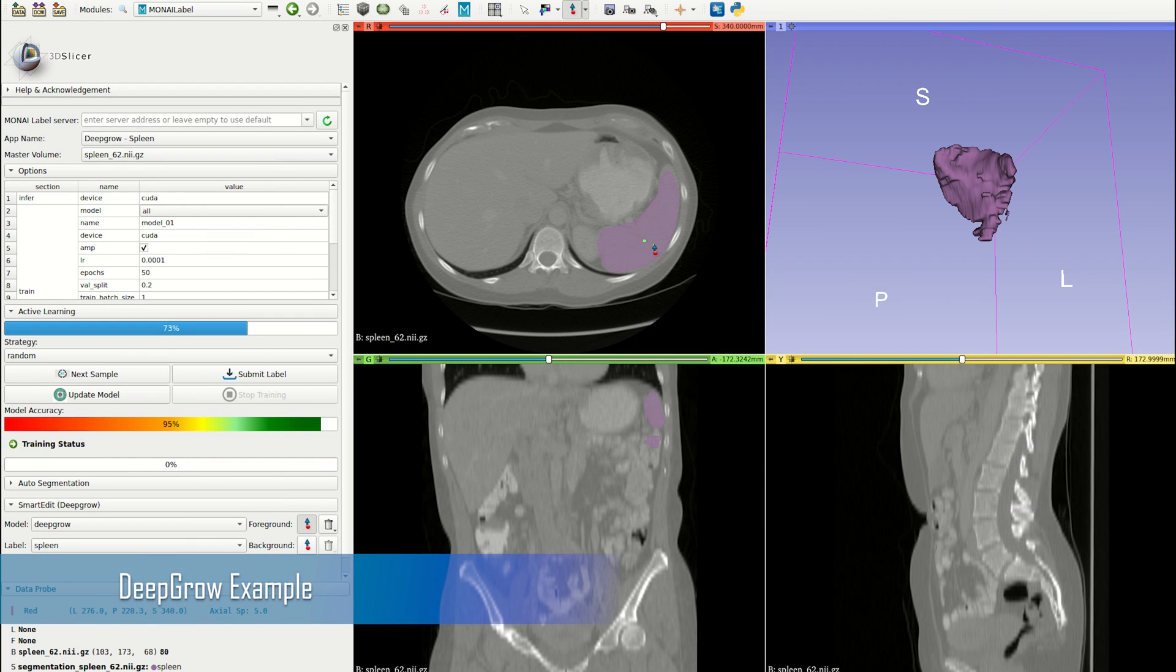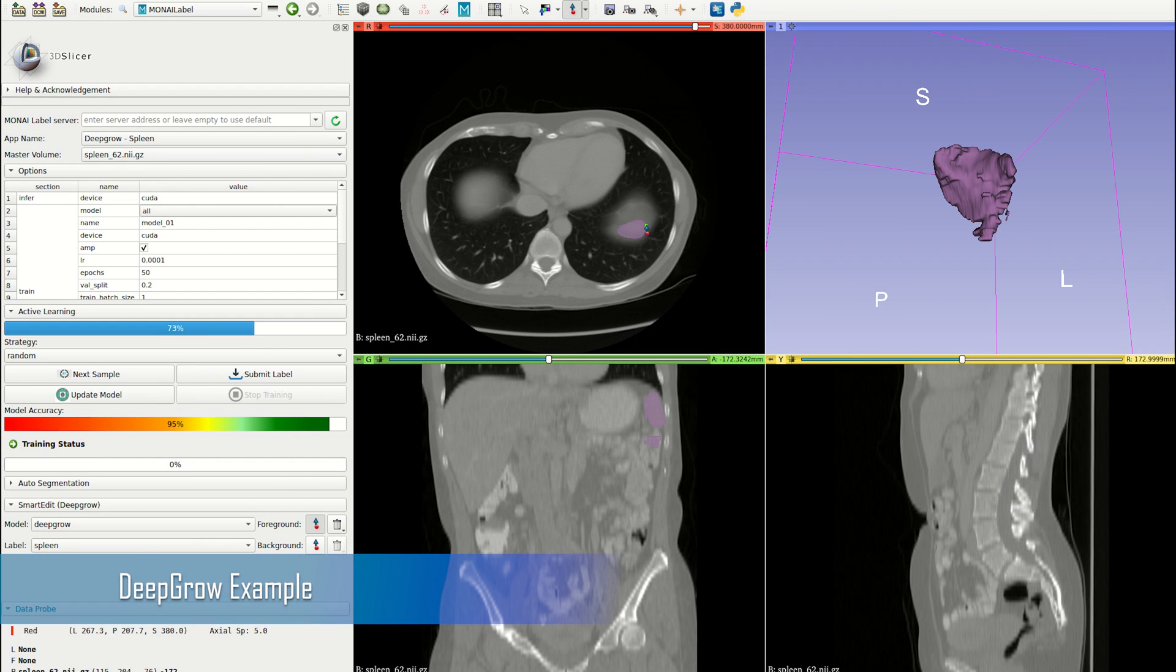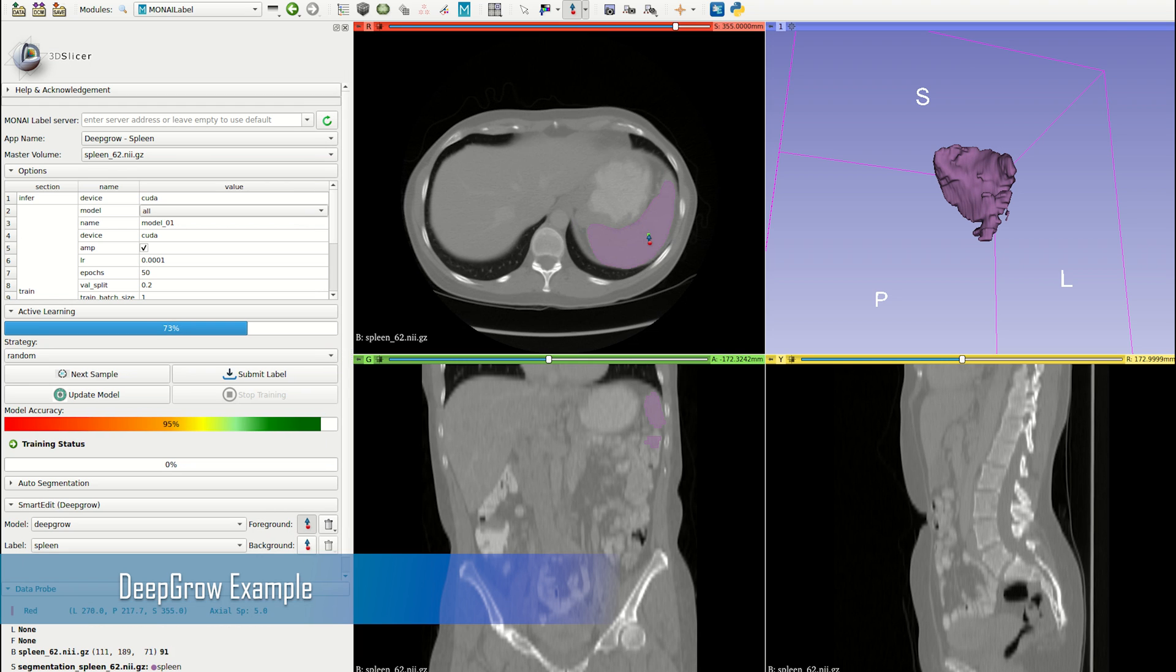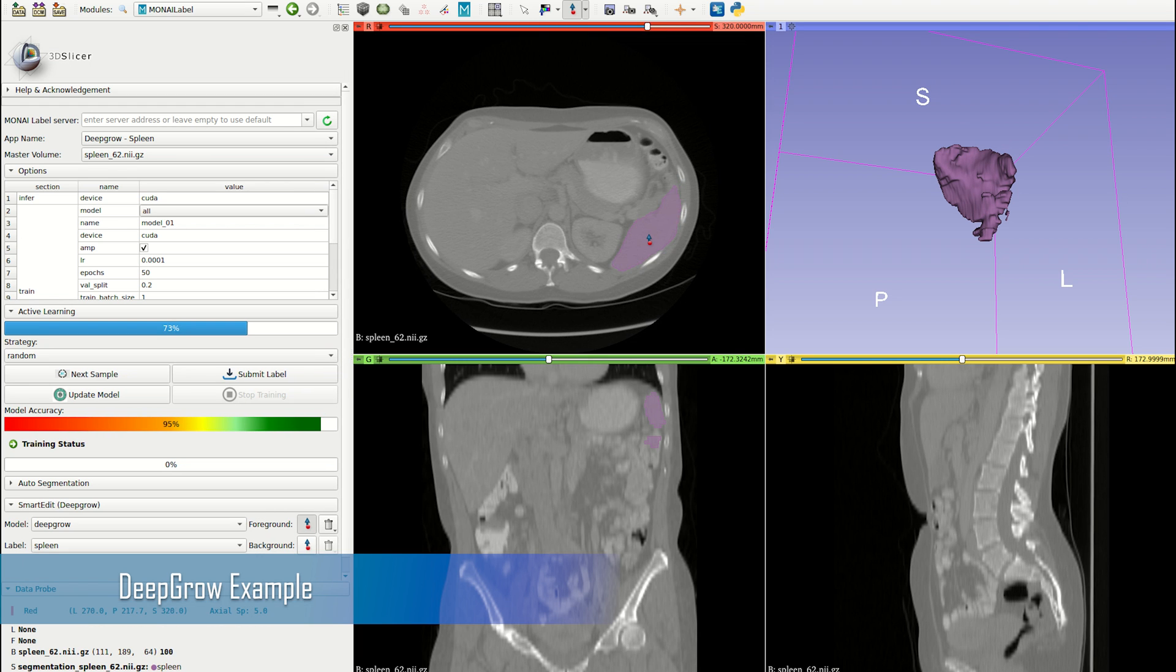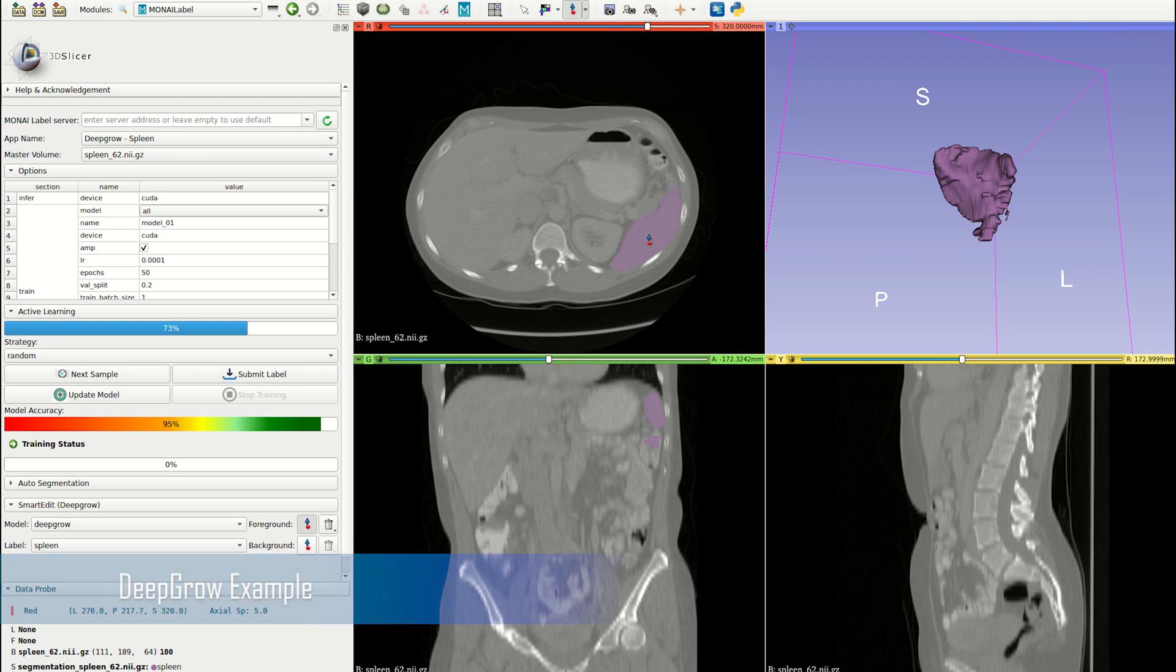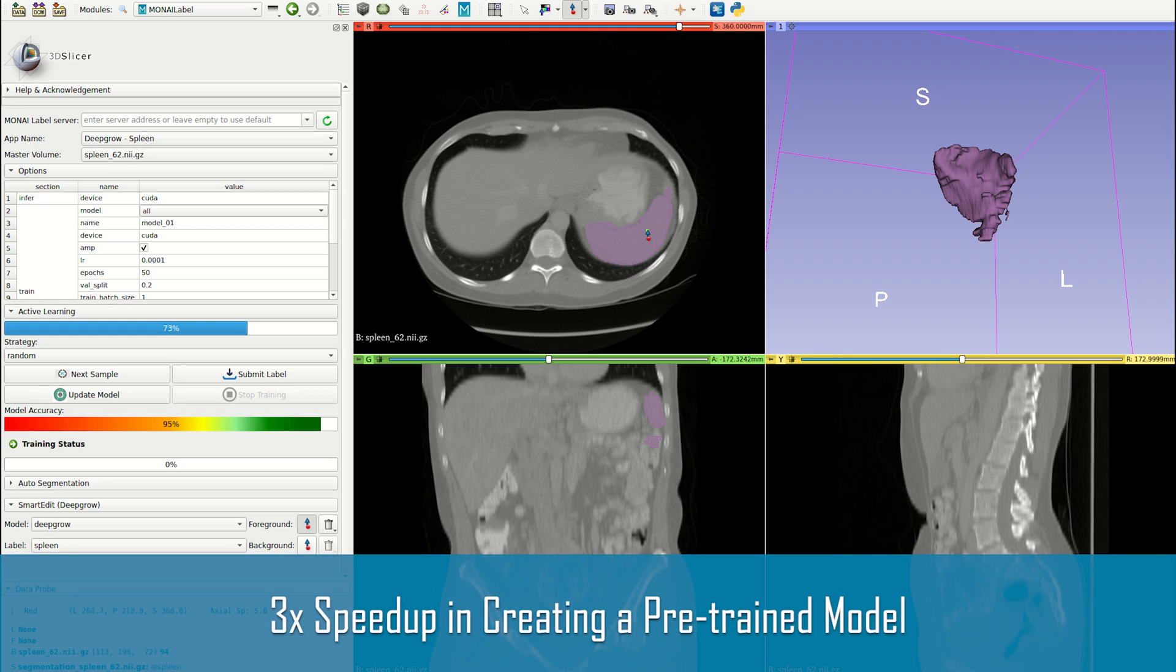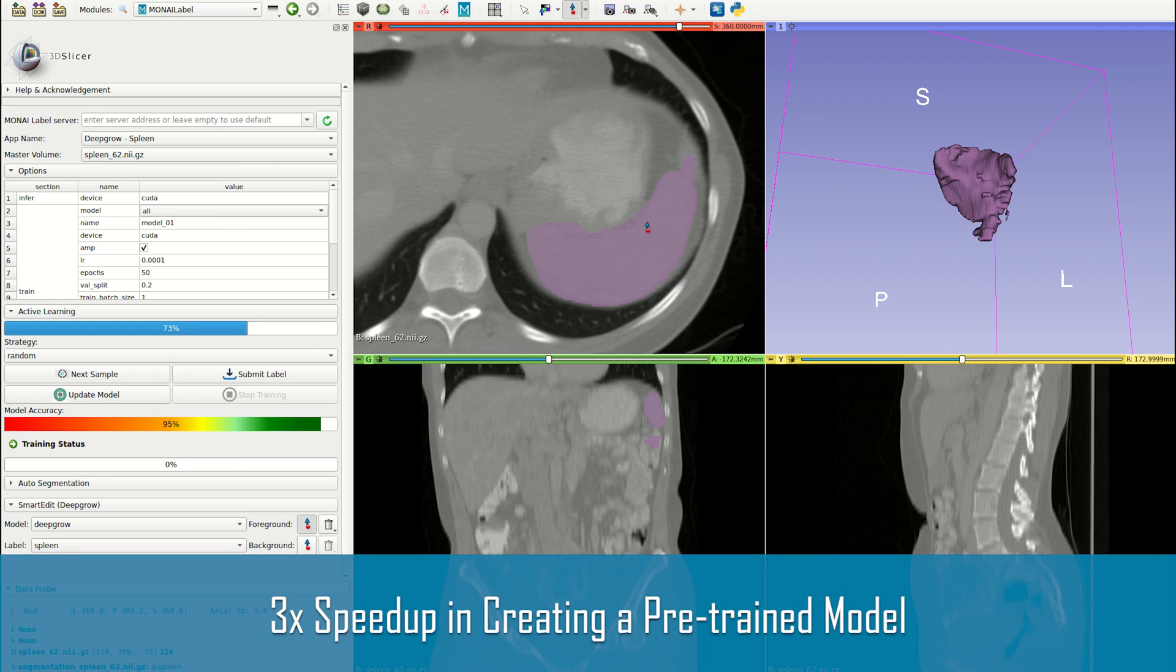To recap, using our DeepGrow or DeepEdit models, you can achieve up to 10x faster annotation per image and a 3x speedup in creation of a pre-trained model for a clinical task.